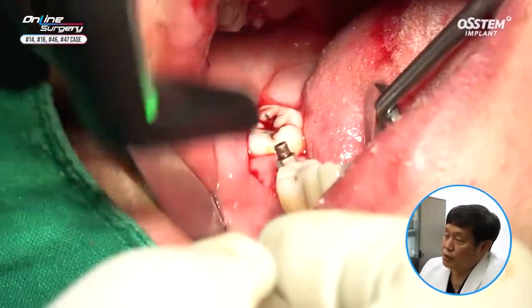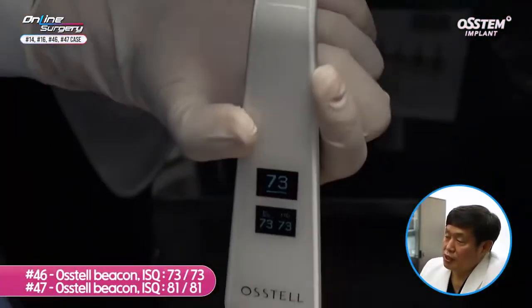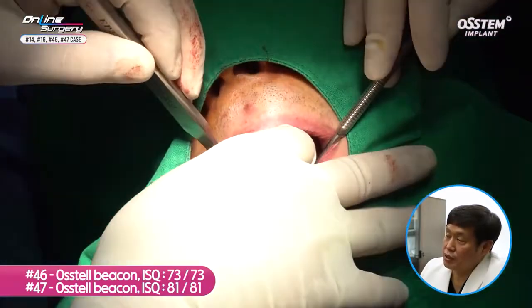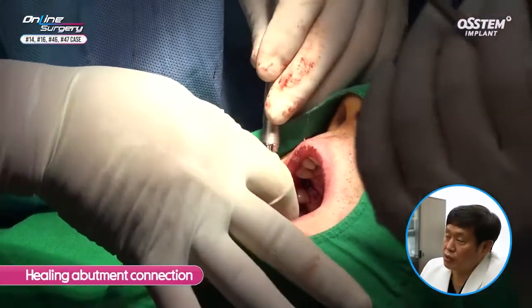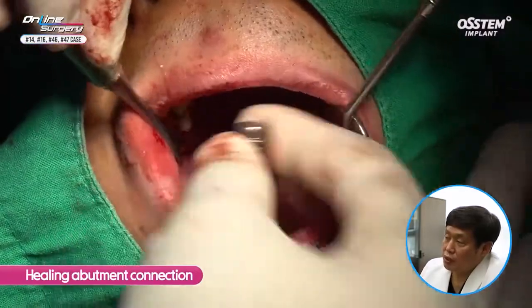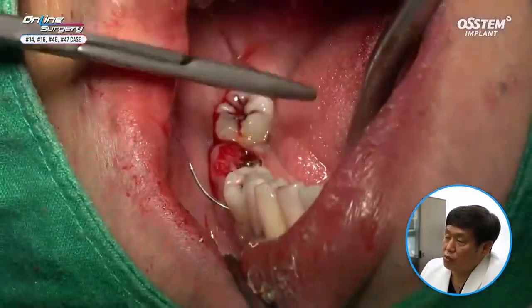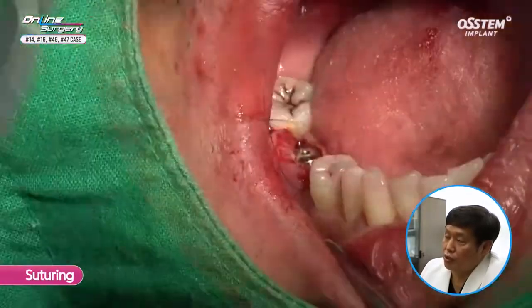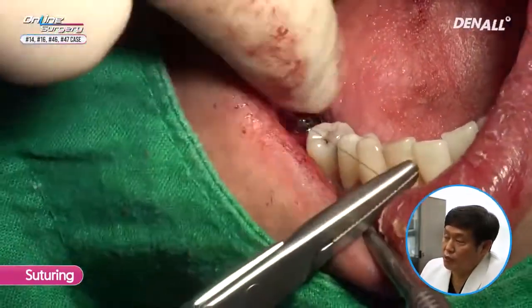ISQ has been measured in the case of number 46. It was about 73, and as for number 47, stability was good. It was about 81. Because primary stability was good, I connected healing abutment, and I did not do any GBR and did suture.